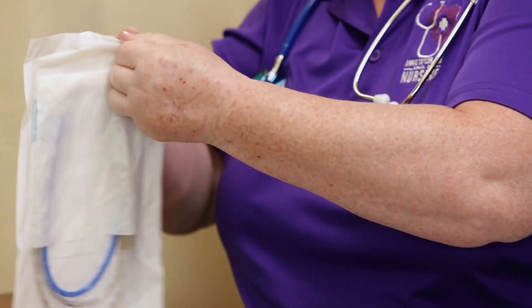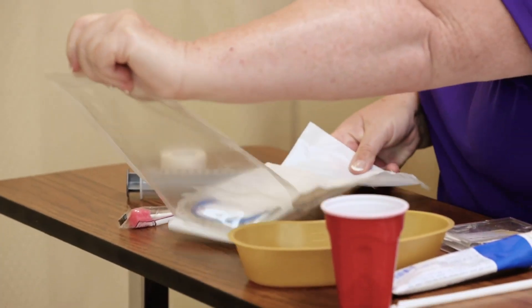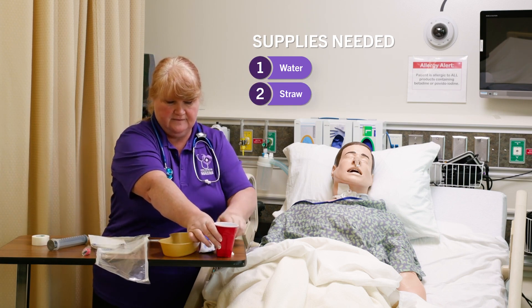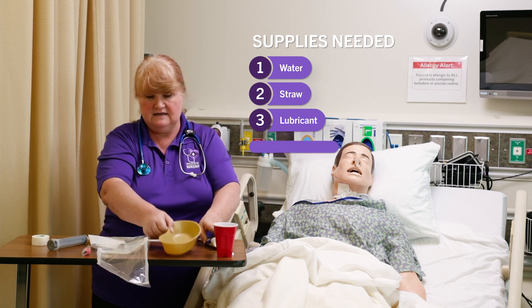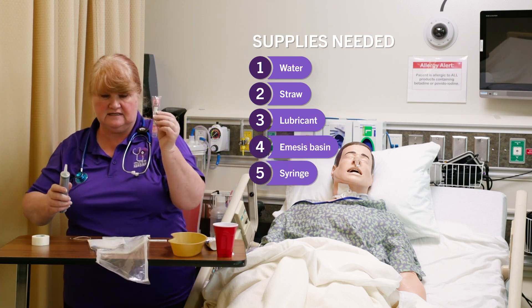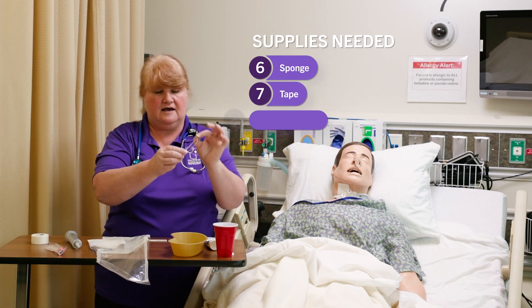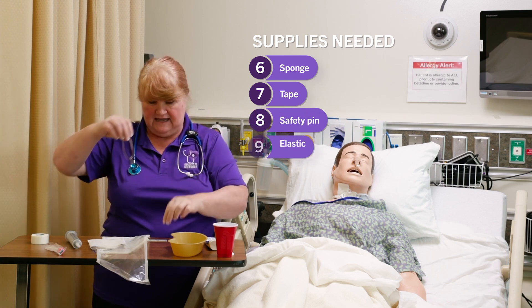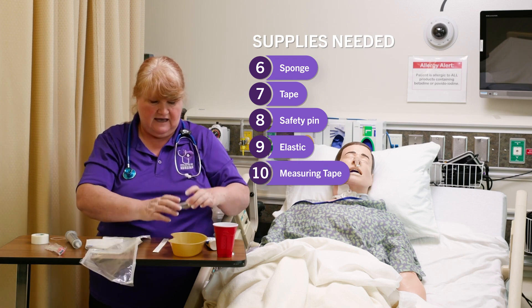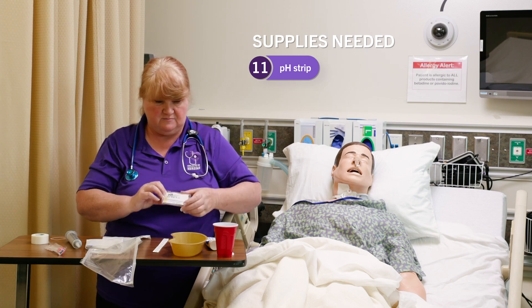You'll want to lay out all of your supplies. You're going to need water, a straw, some lubricant, an emesis basin, a syringe, a sponge, some tape, a safety pin, an elastic, a measuring tape, and a pH strip to check for the pH.